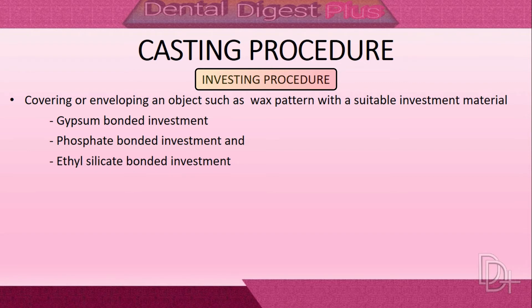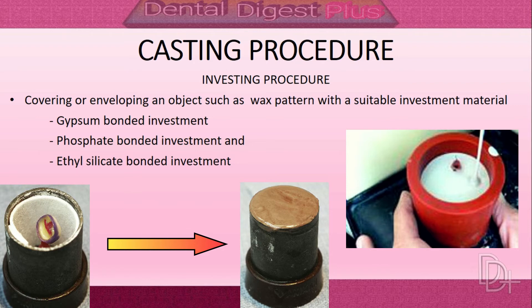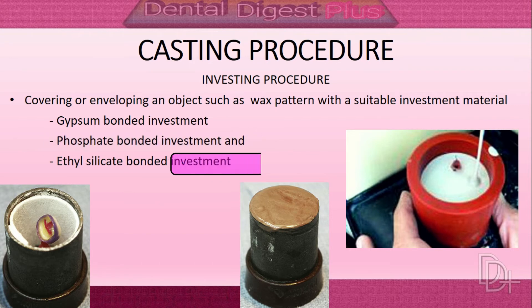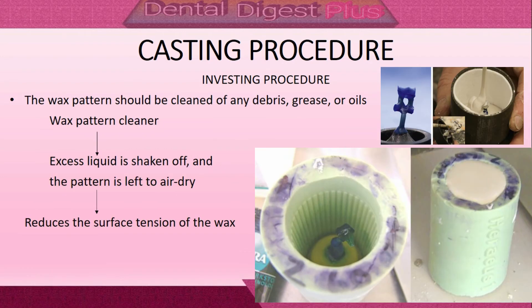The seventh step is the investing procedure — the process of covering or enveloping the wax pattern with a suitable investment material before casting. Investment materials used include gypsum-bonded investment, phosphate-bonded investment, and ethyl silicate-bonded investment. The wax pattern should be cleaned of any debris, grease, or oils using a commercial wax pattern cleaner or diluted synthetic detergent. The thin film of cleanser reduces surface tension and permits better wetting by the investment.